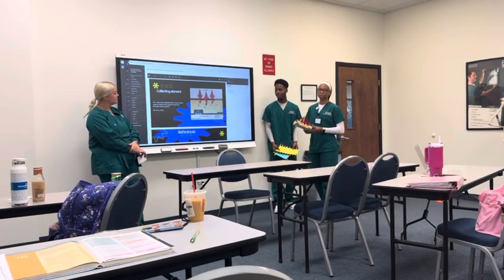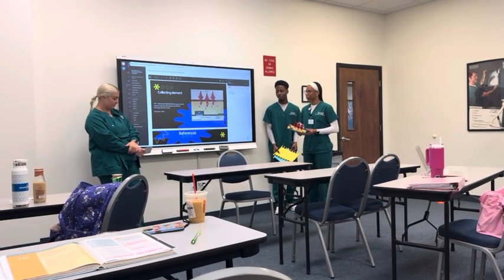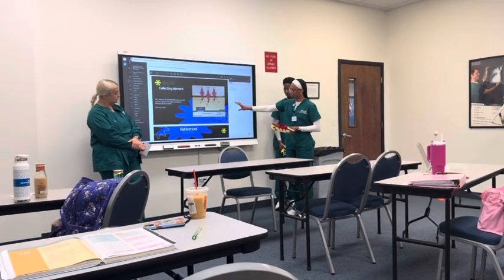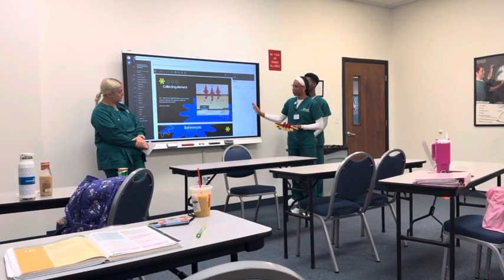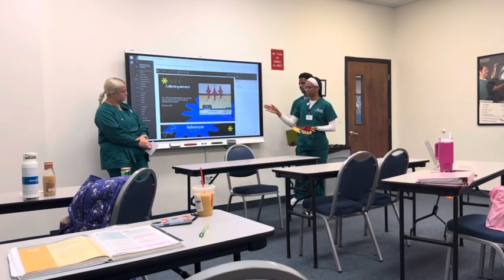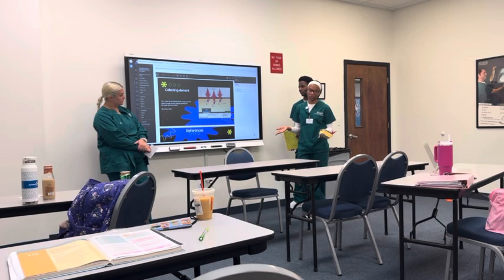And then I have the collecting element, the TFT. With the TFT, like Mark was talking about, the storage capacitor fills up with the energy, and then after that, it waits until the TFT gives the switching action, and it gets sent over to the TFT, and after the TFT, it gets sent over to the ADC.